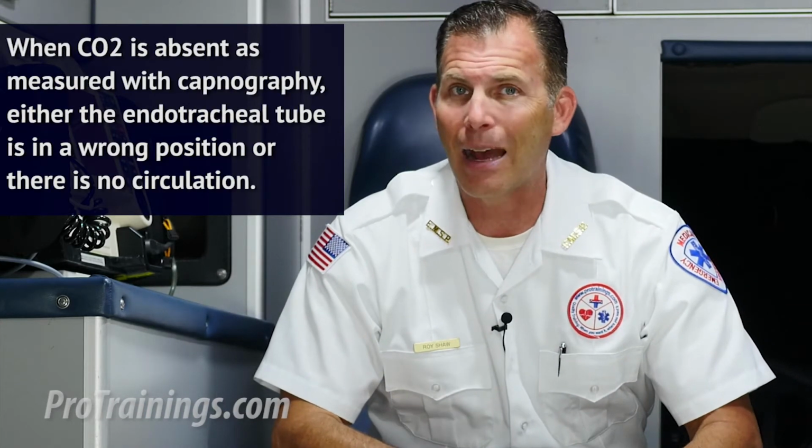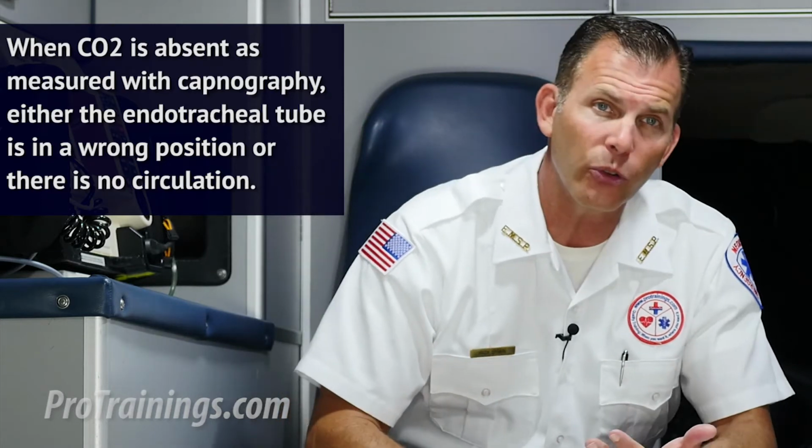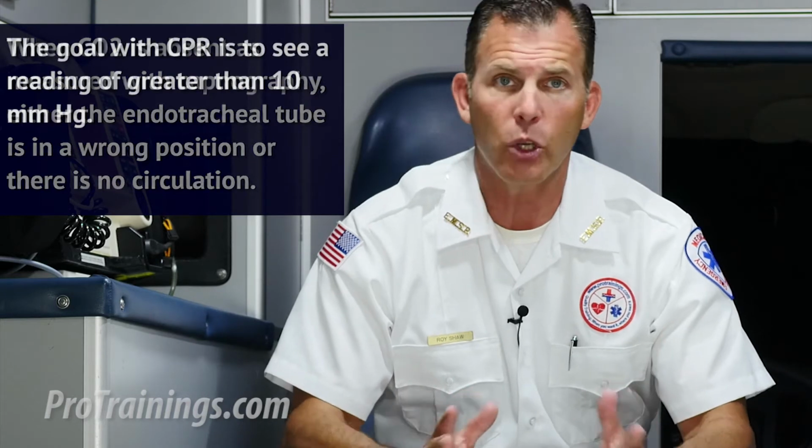When CO2 is absent, as measured with capnography, it means either the endotracheal tube is in the wrong position or there's no circulation. The goal with CPR is to see a reading of greater than 10 millimeters of mercury. If the end-tidal CO2 reading is less than 10 millimeters of mercury, CPR compression depth and rate should be adjusted in order to improve circulation.